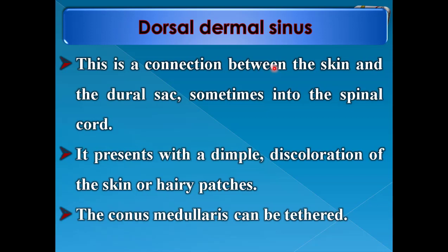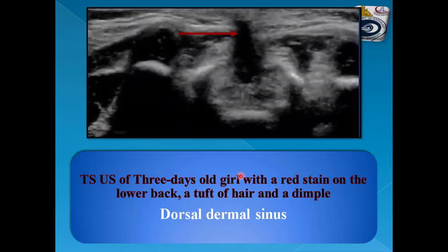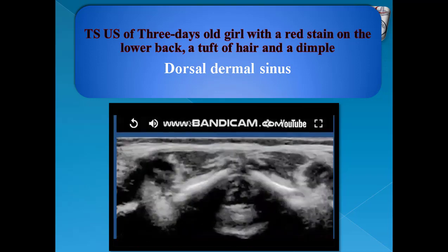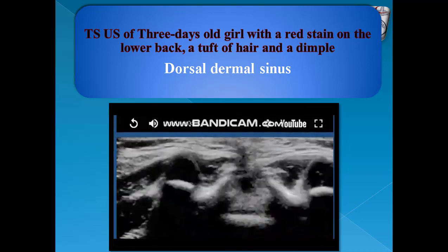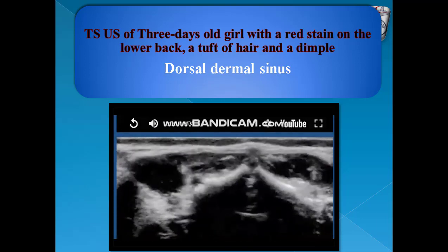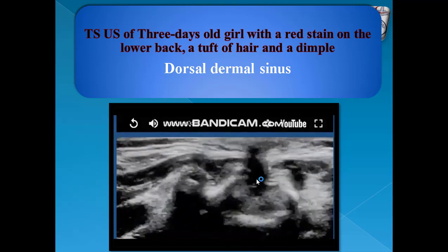Dorsal dermal sinus is a connection between the skin and the dural sac, sometimes into the spinal cord. It presents with skin discoloration or hairy patches, and the conus medullaris can be tethered. This is an example of transverse ultrasound examination of a three-day-old girl with a red stain on the lower back, a tuft of hair, and a dimple. The dorsal dermal sinus extends into the spinal canal connecting the skin to the spinal canal, denoted by the red arrow. This is clearly visible in the cine images.